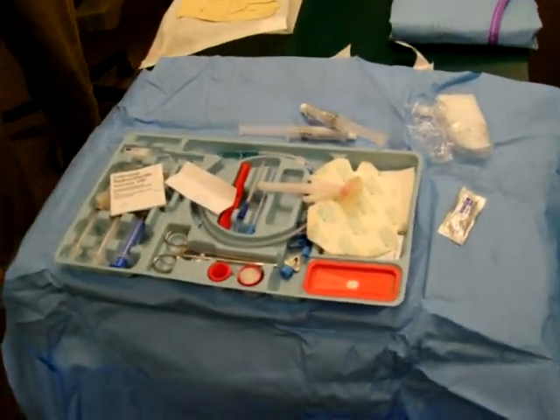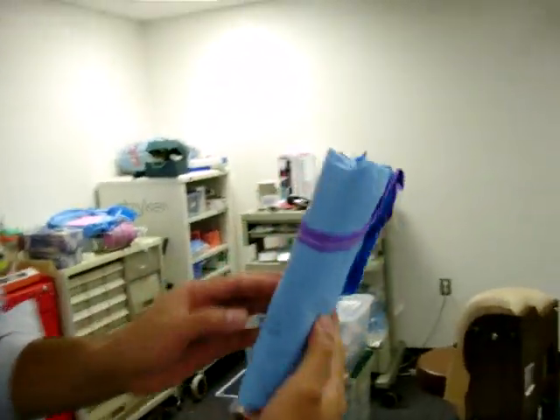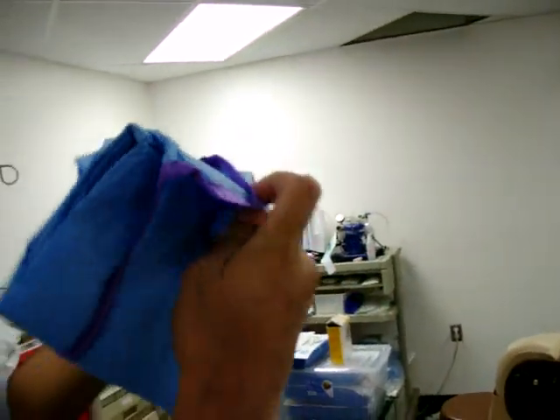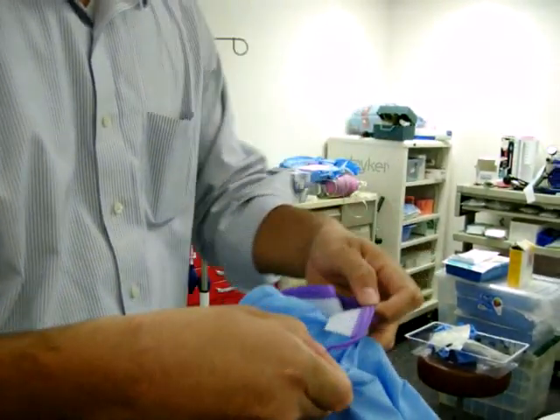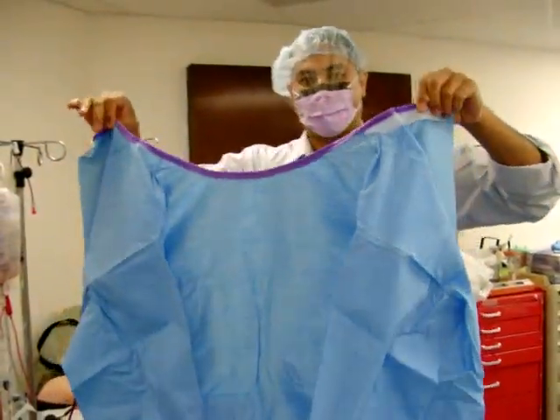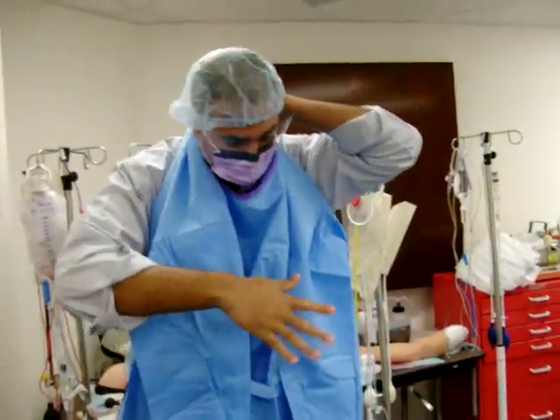My gown is ready. Mask check. Cap check. Now you're going to put on your gown — here's the trick. You'll see this purple lining — it may be clear or blue — and you're going to look for the tabs up front. Try to reach in and pull out these velcro tabs on the inside. Once you do that, you just need a little bit of room and let it fall. If you're doing it yourself, you can turn around and buckle yourself behind here. Hold it with one hand, being sure not to touch anything in your surroundings. Reach in with each hand so the fingers poke out. Sometimes it may become un-velcroed and there's nothing you can do about that, especially if you're by yourself.